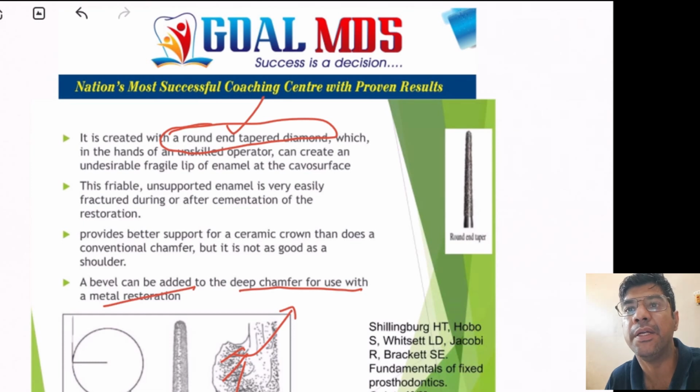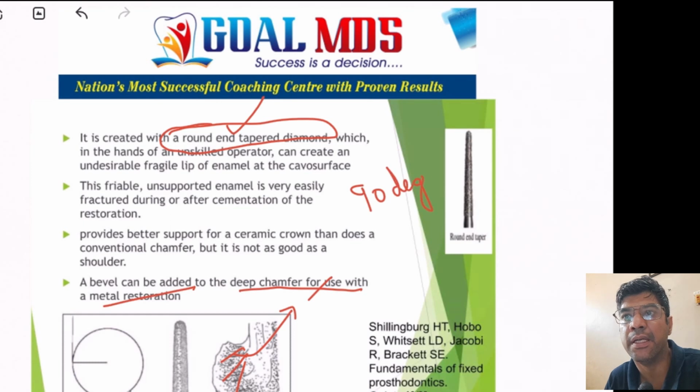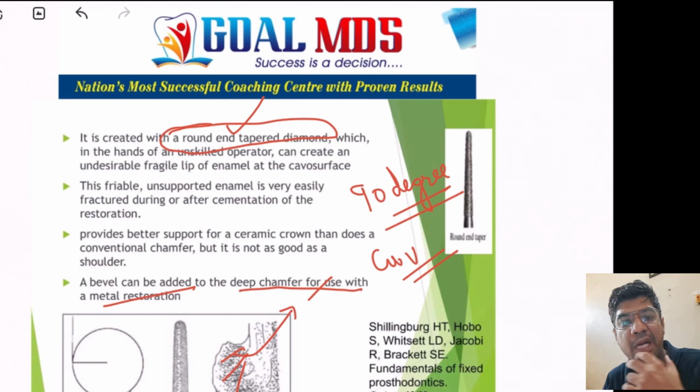A bevel can be added to the deep chamfer. So a bevel can be added to heavy chamfer for the cast metal preparation. A heavy chamfer variation is used to create a 90 degree cavosurface angle with a large round radius.